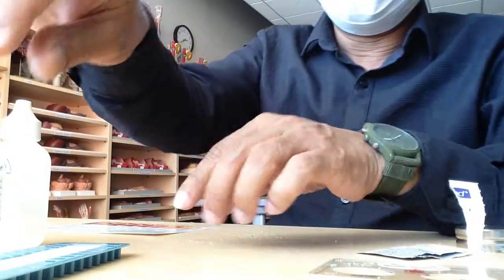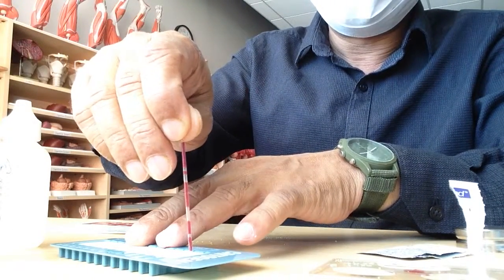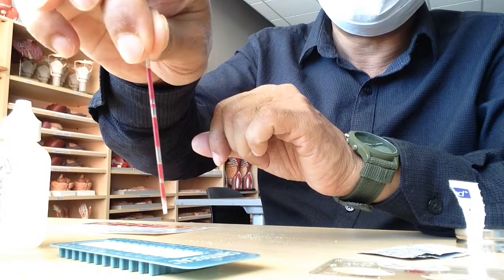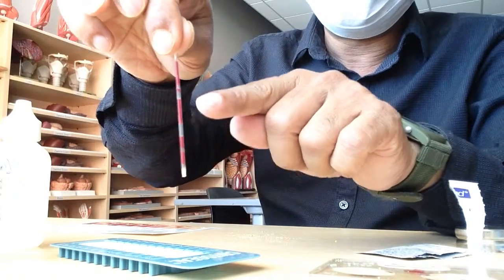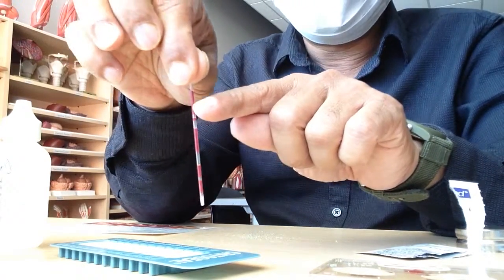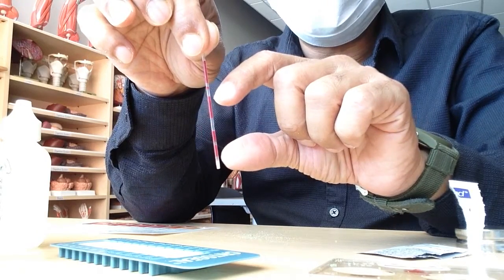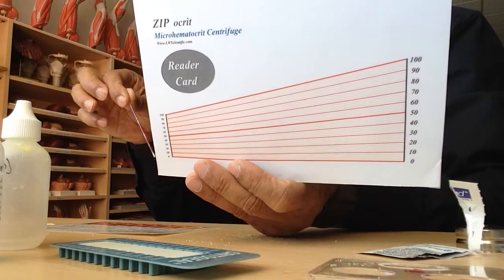Then the last thing is the hematocrit. So to do the hematocrit measurement, I'll put this glass capillary tube in the centrifuge machine and then centrifuge it. And when I centrifuge, the formed elements will go to the bottom and the plasma part will go to the top. And then I'll measure the bottom part against this scale, and that will give me the hematocrit value.